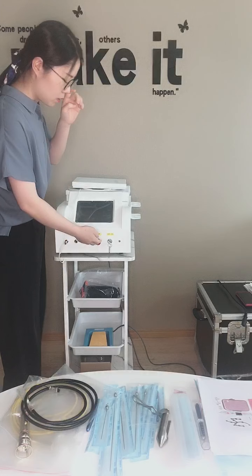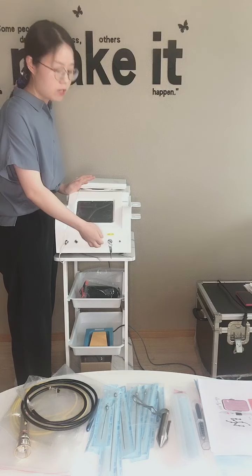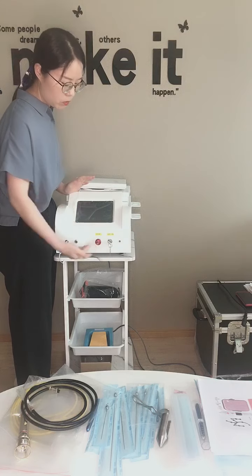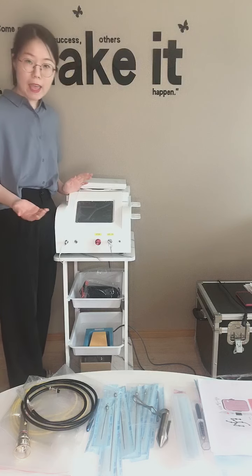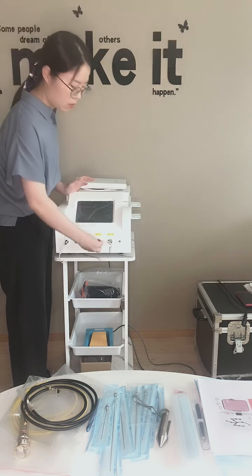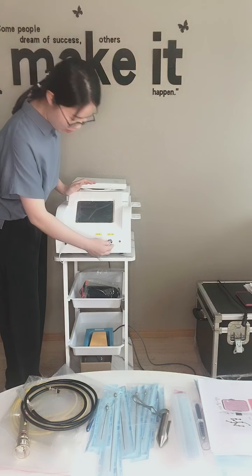And this one is the emergency key. So when your laser is working and if anything happens during the treatment, you can just press it, so the laser will stop working immediately. Some clients, when they receive the laser, told me, Nico, I can't open my laser machine after I press the key switch. Actually, you need to open the emergency key just like this, right? So your laser can work. And this is the key switch.